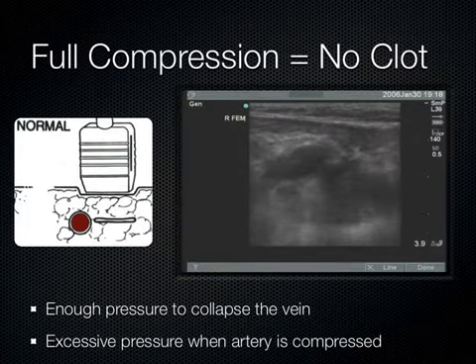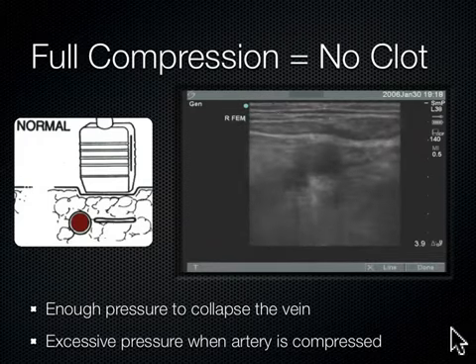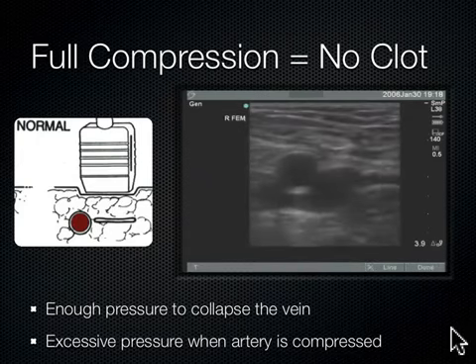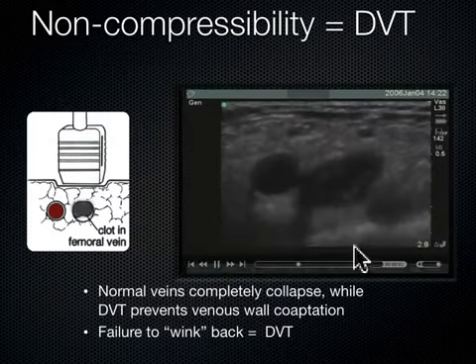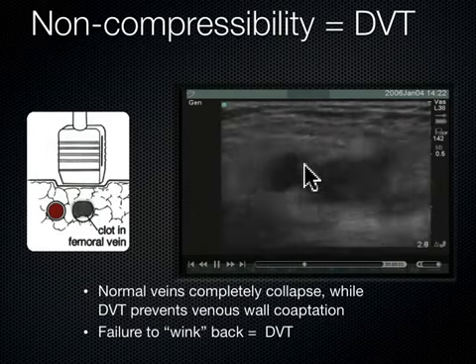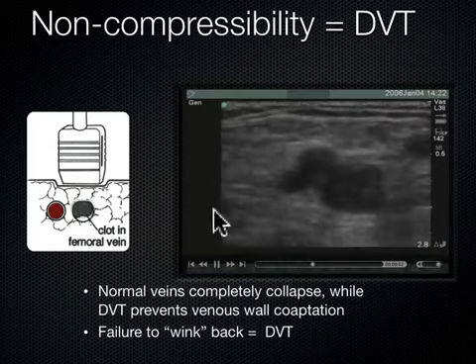This is what it looks like with video. We can see the common femoral vein easily compressible. The arterial system stays open. It's just enough pressure to compress the vein. You know when you're pushing too hard if the arteries actually start to compress a little bit. This is what it looks like when you've got a clot. Okay, which leg is this? Correct, the right leg, because the vein is here, venous, penis, and this is lateral over here.